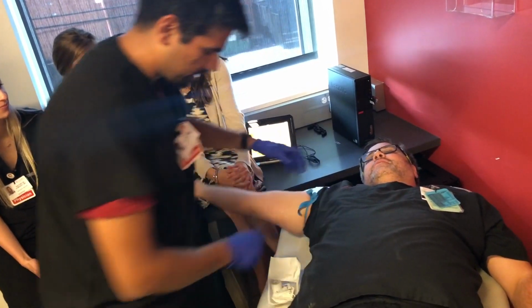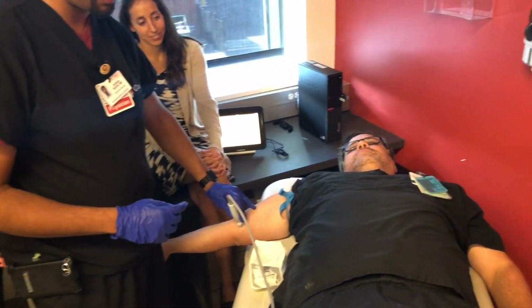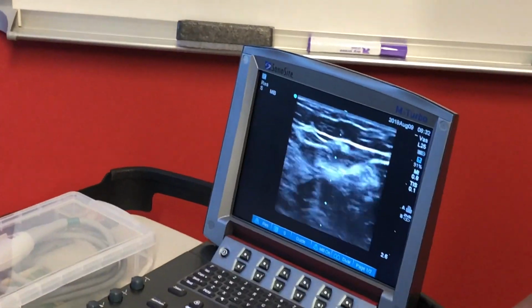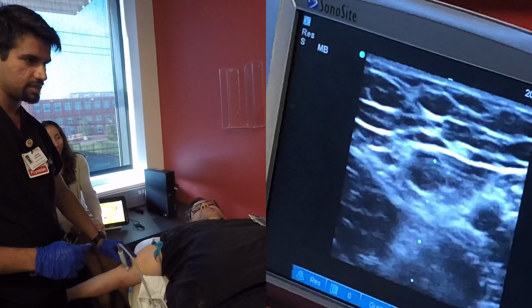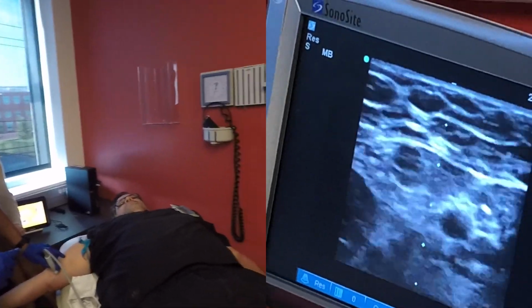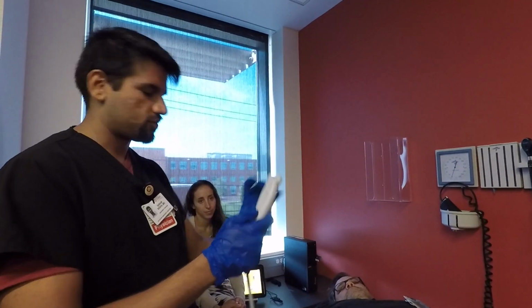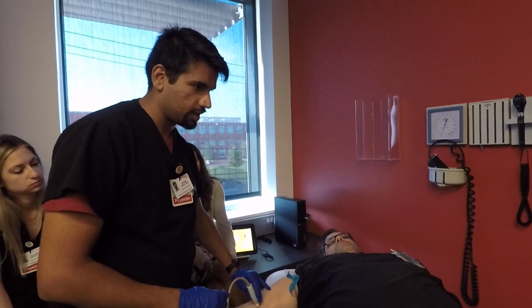All right, so tourniquets are always helpful, and as you can see, we'll look back at the vessel, and the vessel usually gets significantly bigger. So right there, you can see that the basilic and the superficial brachial get nice and large. Great looking vein. So the other thing to remember is before you start, you always make sure left is left and right is right on the screen. So we'll do that here. And left is left, right is right.